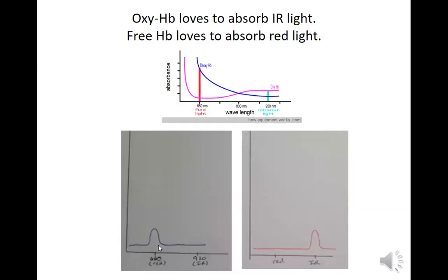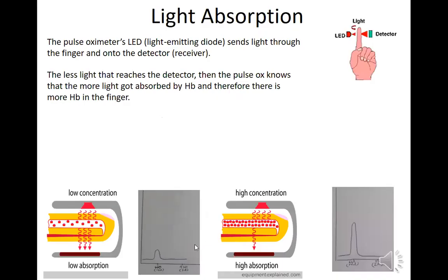Okay, so again, this is showing just how much. I'm not going to put these on. Just note, this is a little different. Of course, the nanometers are slightly different, but we're going with the 920 and 660. So it shows how much is being absorbed from both. Total hemoglobin is both. It depends on the concentration within that blood of oxyhemoglobin, whether you're going to get more 660, which is a problem, or less 920. It depends on which one it is.